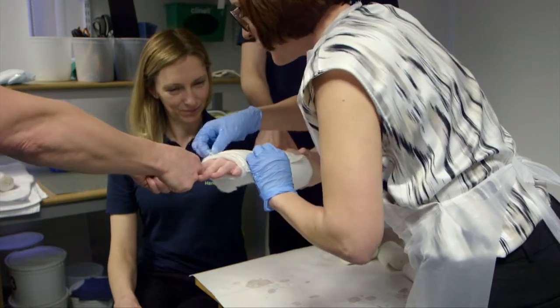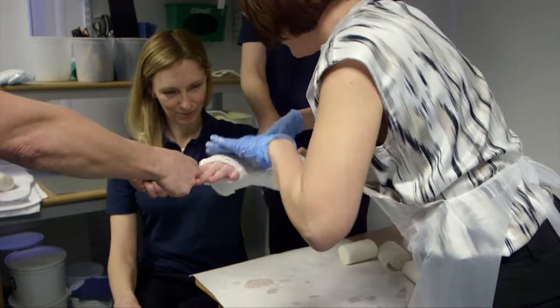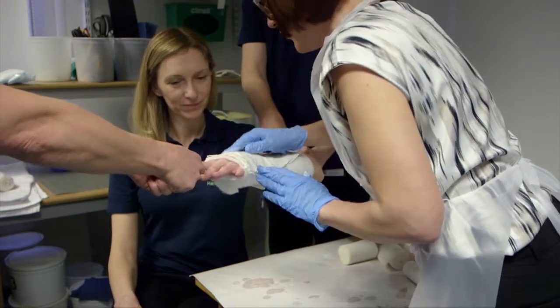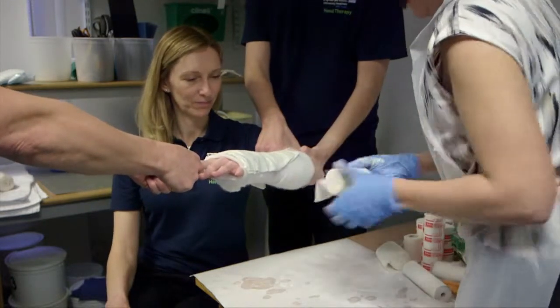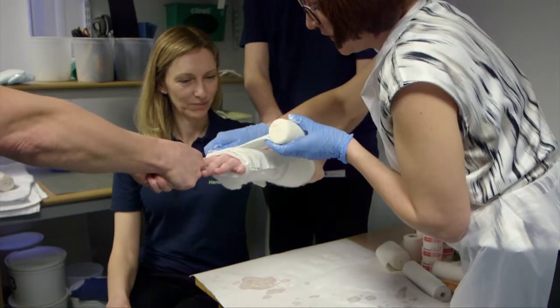It is always worth reducing the fracture and applying a well-moulded plaster even if you think the patient is going to need surgery, as this helps with pain relief and allows them to exercise the fingers.